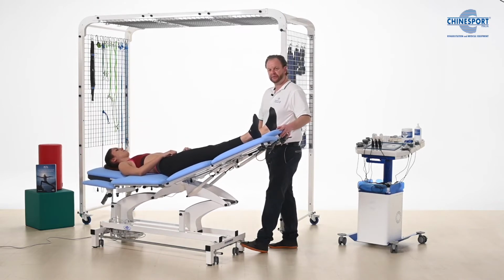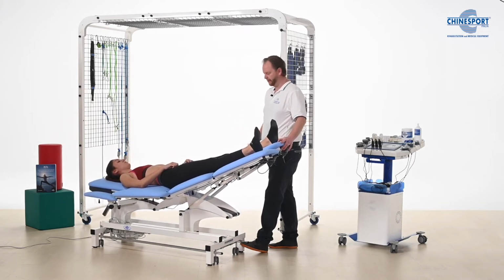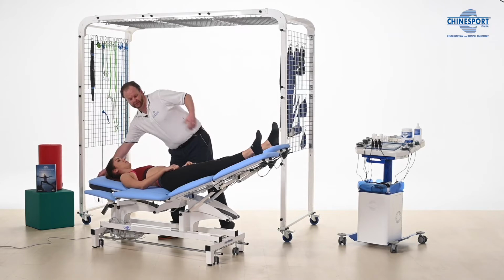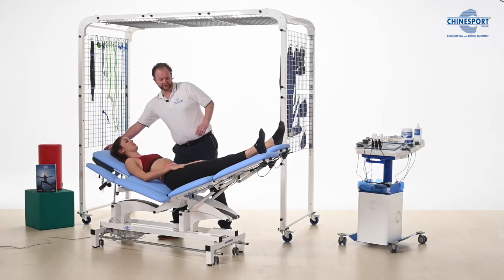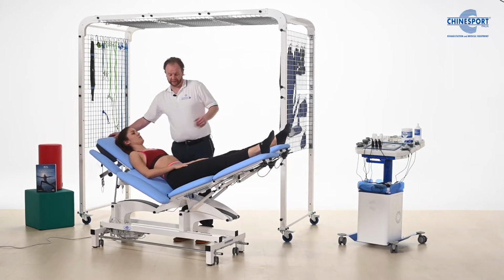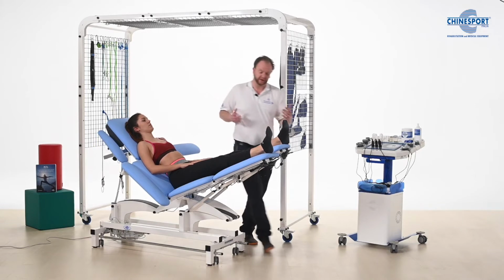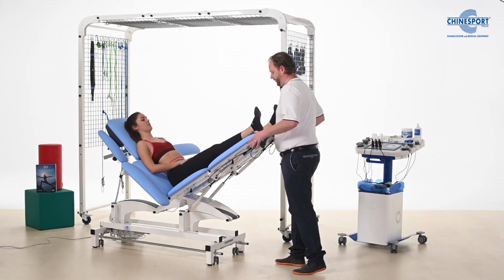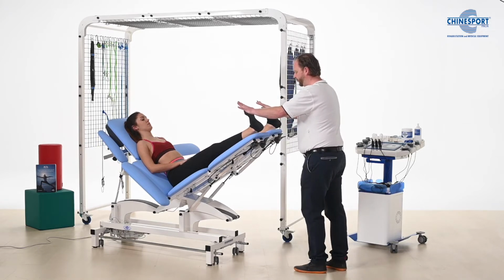people often have problems with hamstring stretches. They're straining against the stretch, and the beautiful thing about this use of the table is that we're letting gravity do all the work. And when gravity does all the work, then the patients are very relaxed, and the patients can feel more what's going on, and they can relax more and go into the stretch and really work into it.